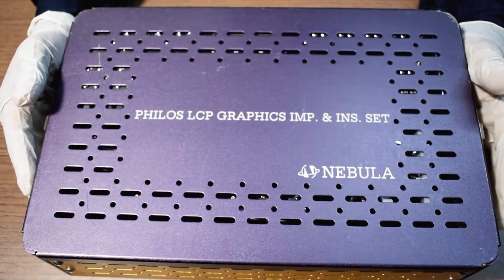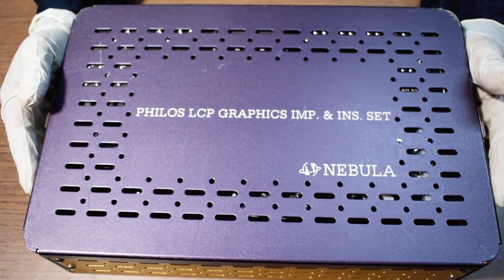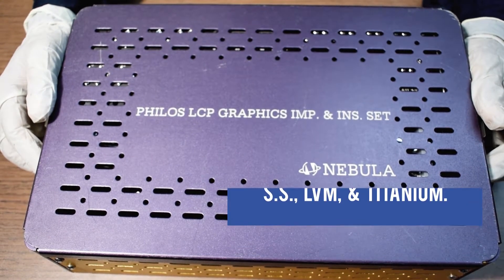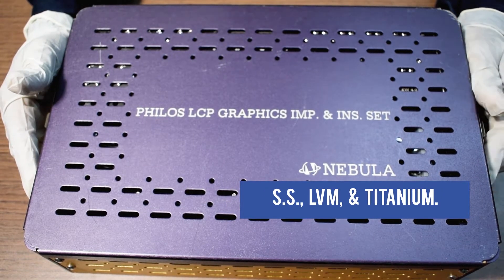This is Low and High Profile Phyllos LCP Plant and Instrument Set, available in SS LVM and Titanium materials.